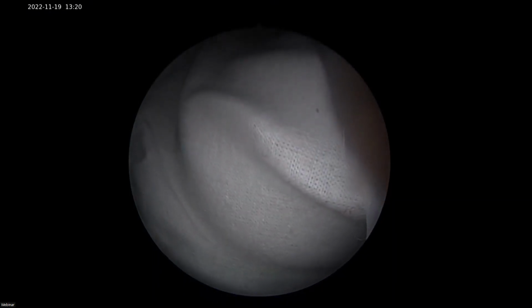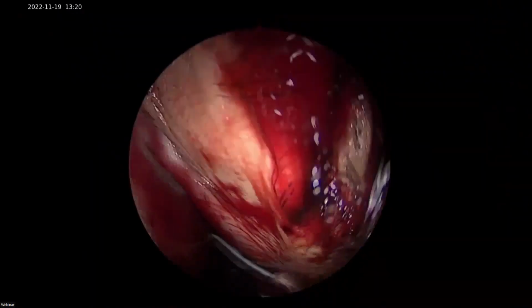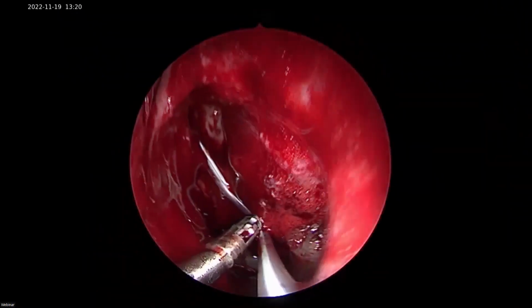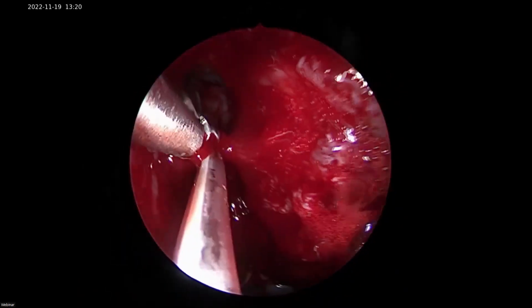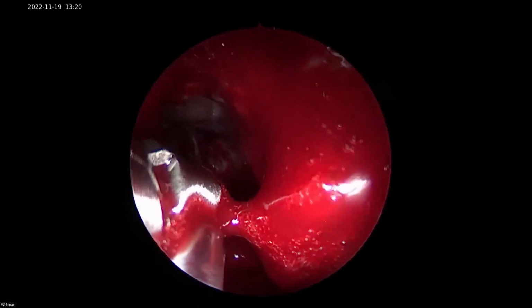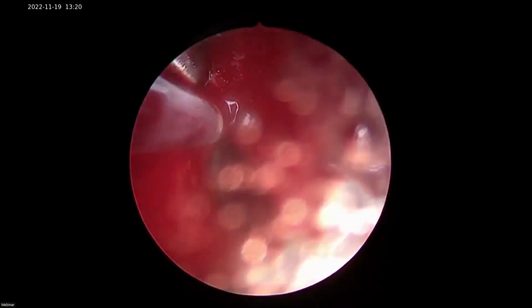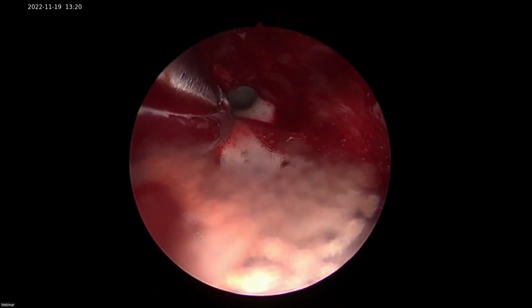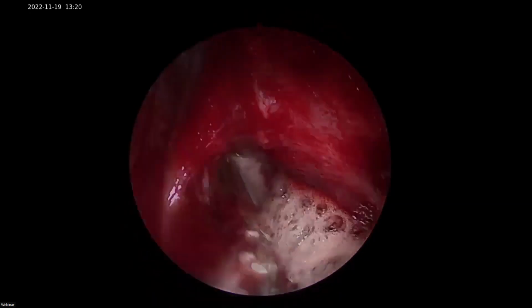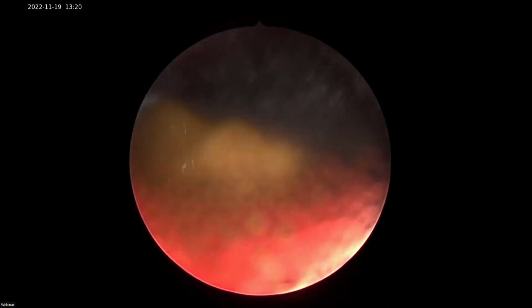Dr. Hetal, yes madam, are you doing that right now? Yes, I'm trying everything to get rid of it. They have taken a catheter halfway inside, taking it right till there. Doing a suction? I have put an oxygen catheter there, through the suction.